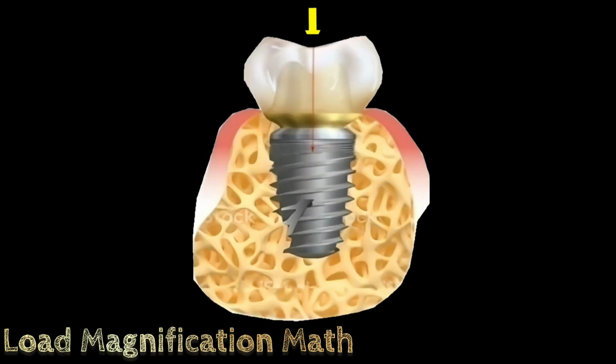The axial load, as and when applied to the implant prosthesis, passes along the length of the implant body, which is favorable for the long term success and clinical longevity of the implant.